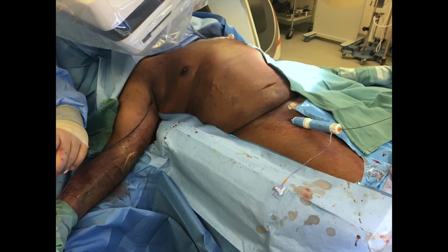The decision to take him to the operating room and perform a venogram with possible intervention was made, and under ultrasound guidance, his right axillary vein and right common femoral vein were accessed. We then exchanged on the right axillary vein the sheath for an 8 French sheath, and in the right common femoral vein, as you can see here in this picture, we used a 7 French Aptus Tour Guide sheath.